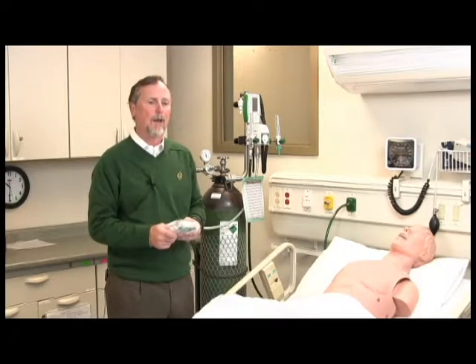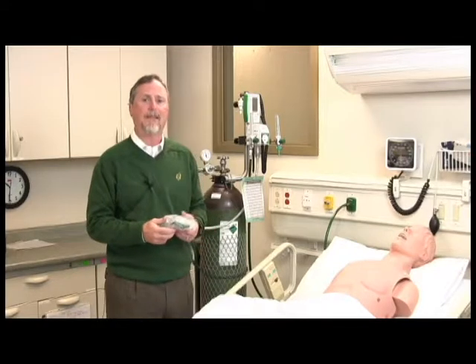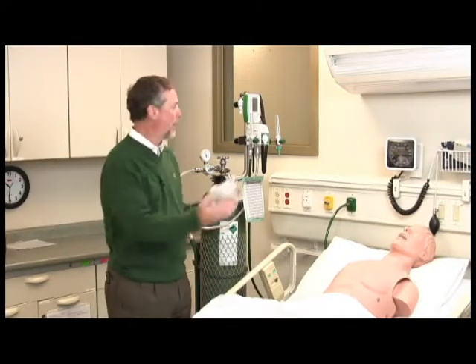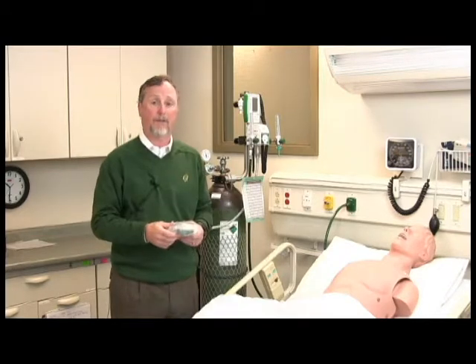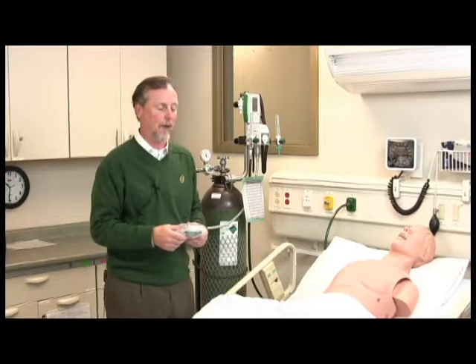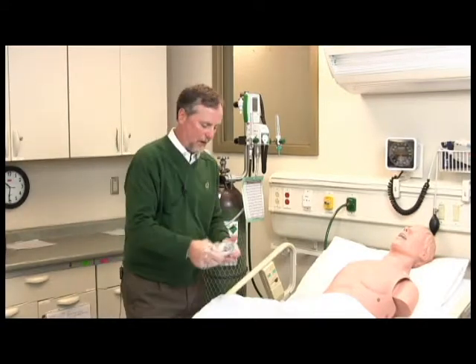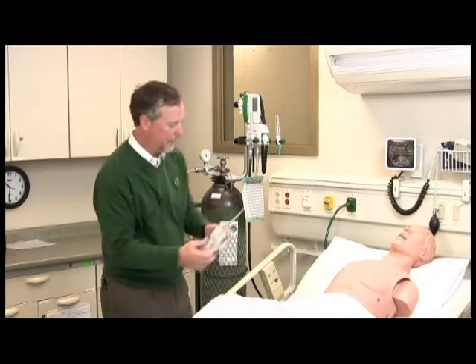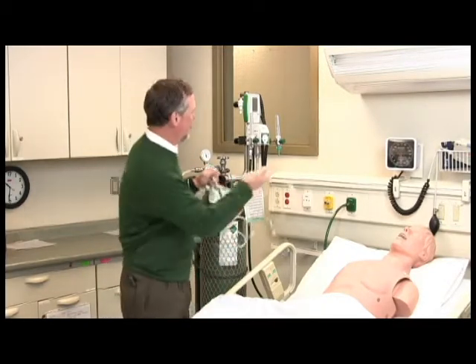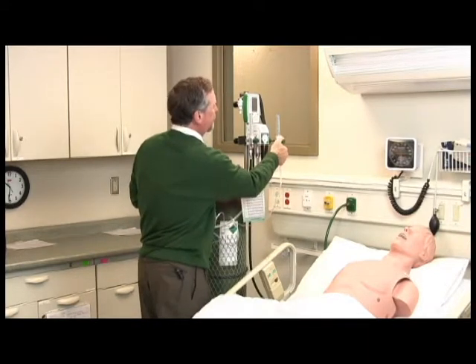We do caution people, and we do advocate that you use Heliox on label, so that whatever you hook up to the Heliox blender is a device that is approved for Heliox use or has been tested with Heliox through it. So in this case, we have a non-rebreather. So we have our friend here who is in a little bit of distress. We connect our non-rebreather up to either of the flow meters, but we'll use this flow meter in this example.